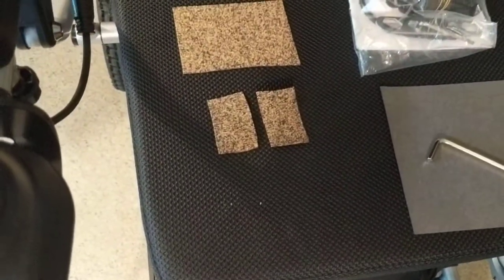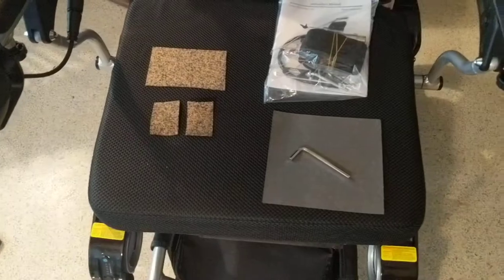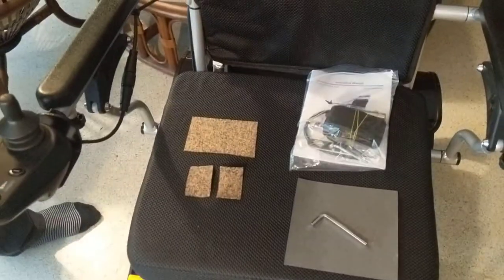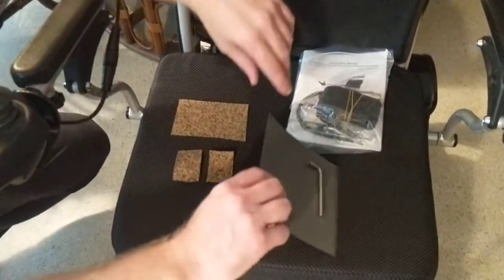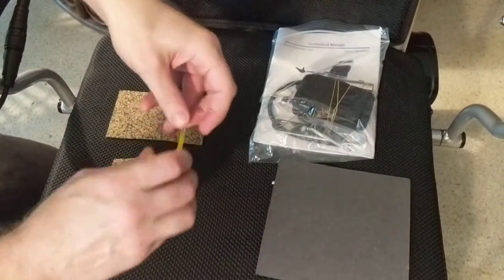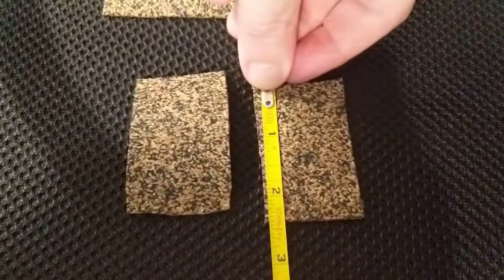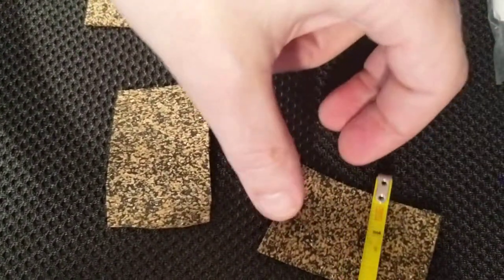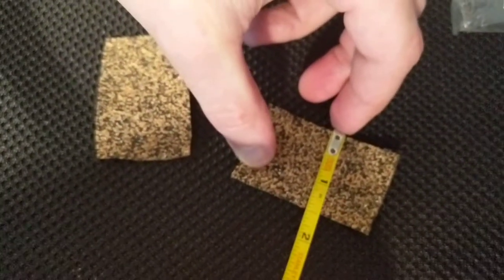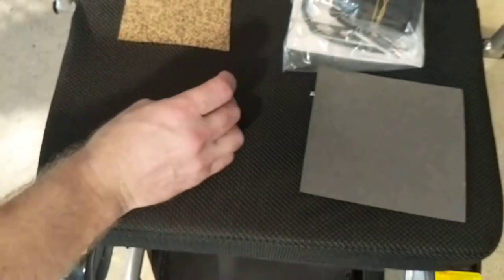I'm going to hand the camera off and we're going to start. If you wanted to get your own piece of material, something thin — a piece of rubber is perfect. Looking at the measurements, we're looking at approximately two and a half inches by approximately one and a half inches. That's very important.